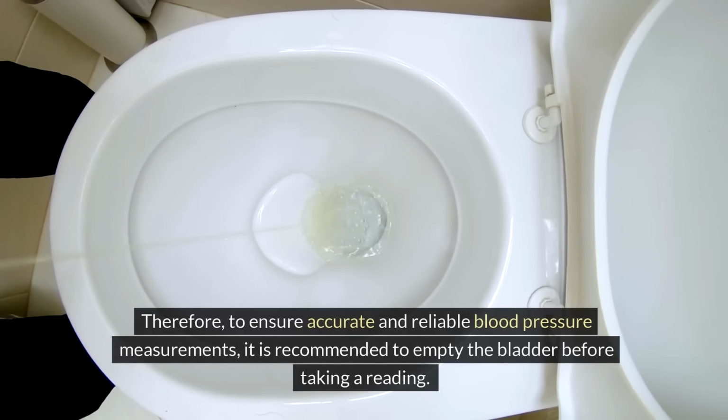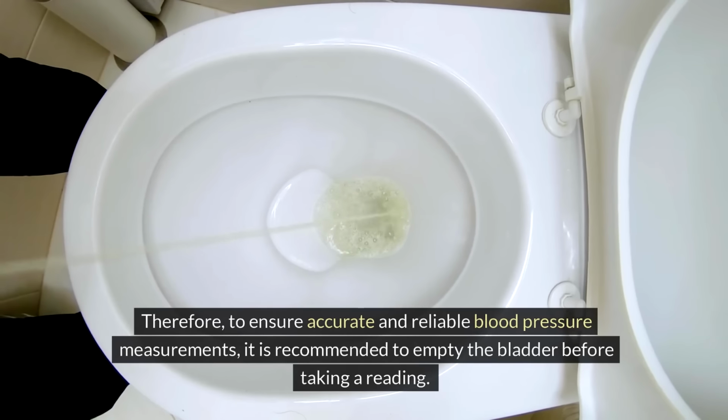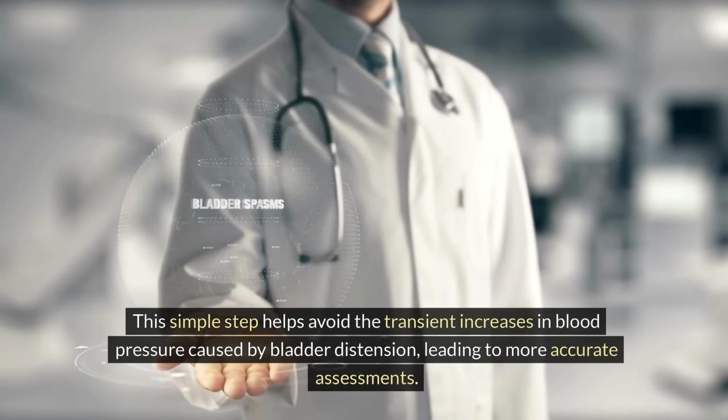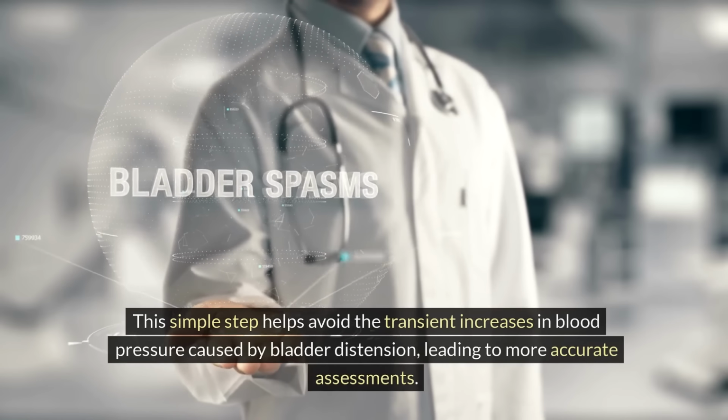Therefore, to ensure accurate and reliable blood pressure measurements, it is recommended to empty the bladder before taking a reading. This simple step helps avoid the transient increases in blood pressure caused by bladder distension, leading to more accurate assessments.